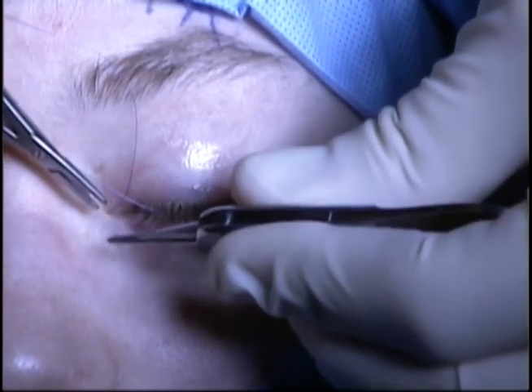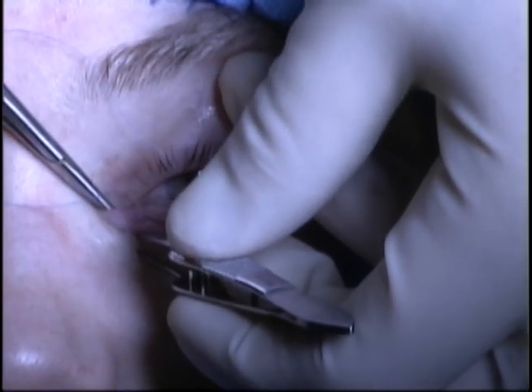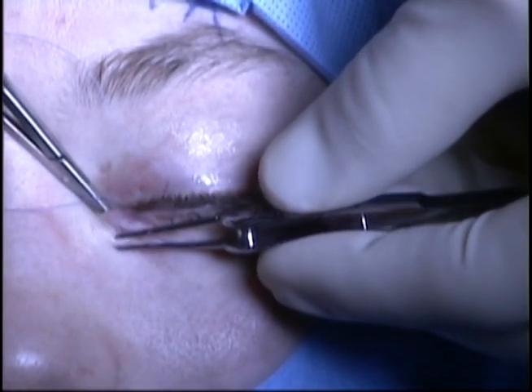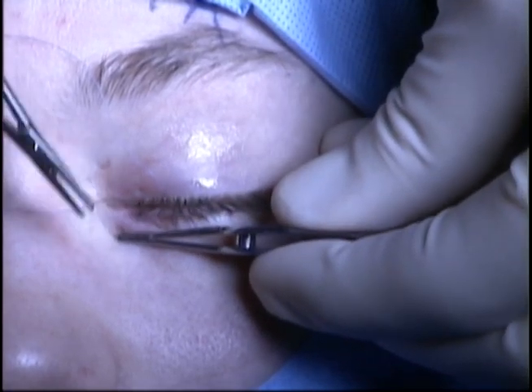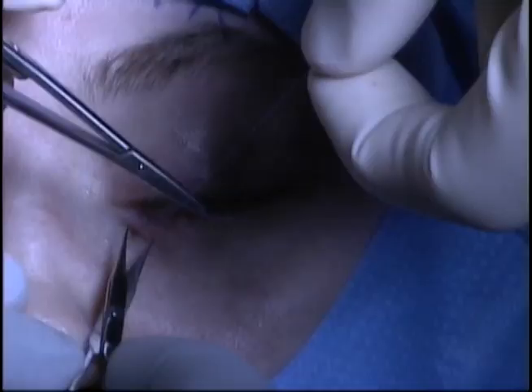This will prevent displacement in the early postoperative period. I do not use permanent sutures to fixate the tube unless the patient has issues with tube displacement. If that were the case, a purse-string suture would be placed around the conjunctiva and the knot would be buried medial to the tube. The vicryl suture placed here can be removed at the one-week follow-up appointment.